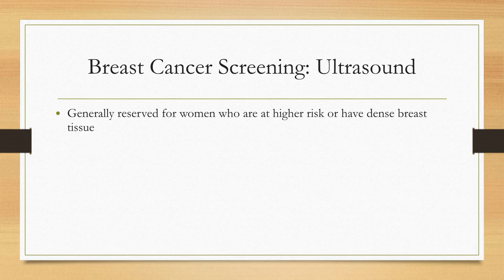As far as screening for breast cancer, we also do use ultrasound, which is becoming more and more used. So what happens is a lot of patients will come in for their screening mammogram and will also get a bilateral screening ultrasound at the same time. That's where you would go in the ultrasound, and a technologist will scan both of your breasts, the entire breast, just looking for any suspicious mass, or look at the lymph nodes as well.